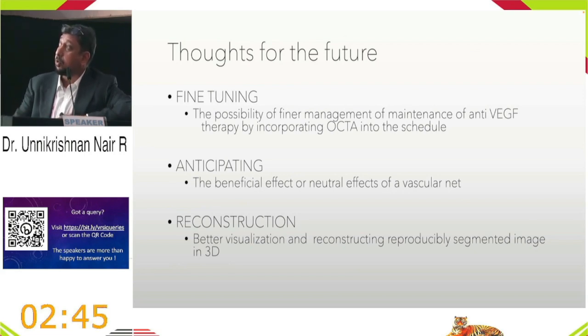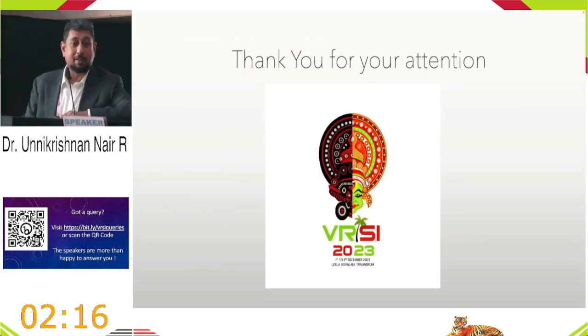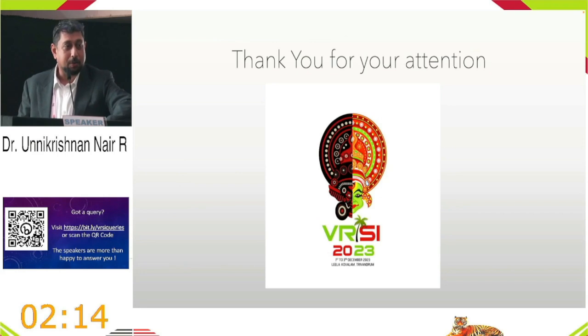The thoughts for the future would be that we are able to fine-tune our anti-VEGF protocols by incorporating OCTA into subsequent visits and modulating our protocols. It may help you in anticipating vessels, whether they're regressing, progressing, beneficial, or coincidental. And eventually, reconstruction of OCTA protocols will give you a layer-wise or depth-wise analysis of the vasculature in a better 3D modulation.